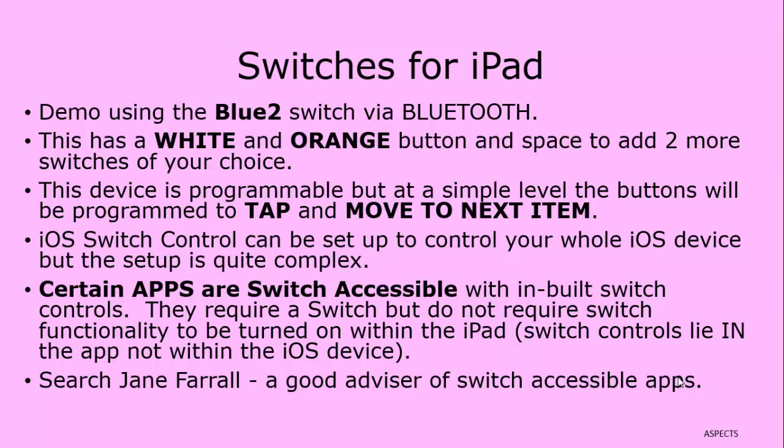The demonstration will use a Bluetooth switch which will be attached via Bluetooth. It has a white and an orange button and space to add 2 more switches of your choice. The device is programmable, but at a simple level, the buttons will be programmed to tap and move to next item.